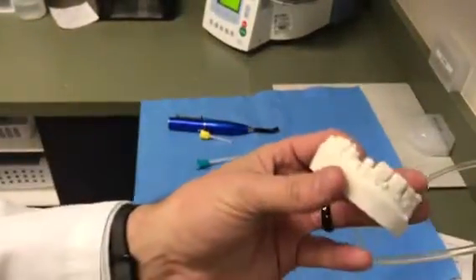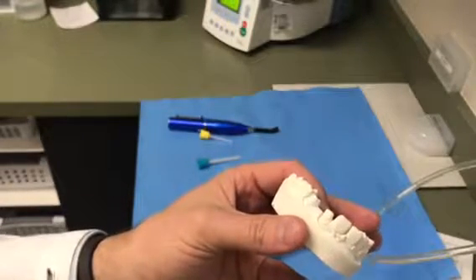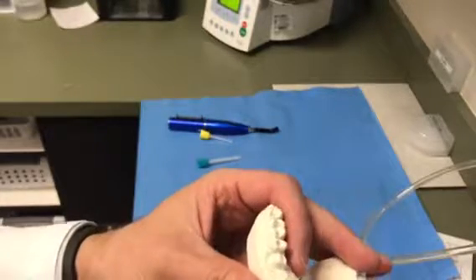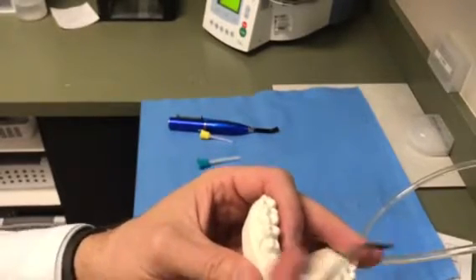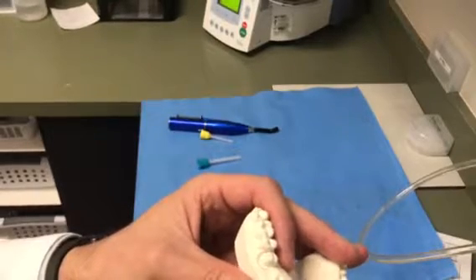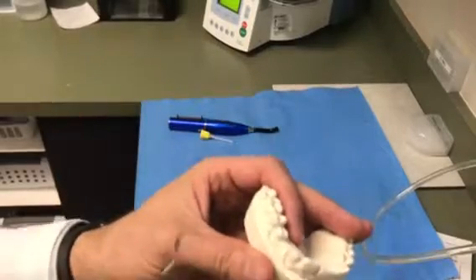You can go a step further. I've seen these little tabs that are almost like machinist gap tabs, where you get different really thin thicknesses that you can put in between until you have a measurement of that gap. I've seen some doctors even use those to get the gap exactly the same as it is in the mouth.